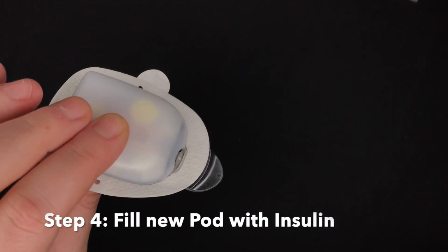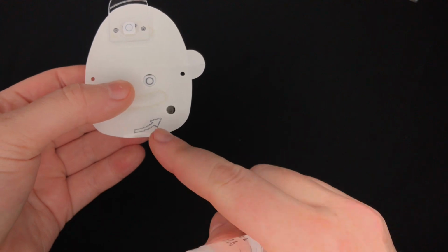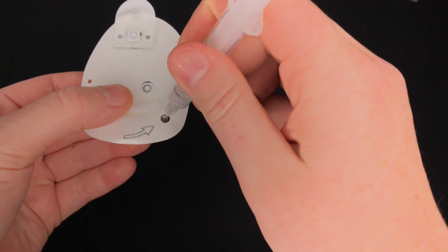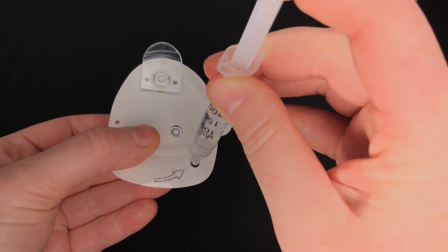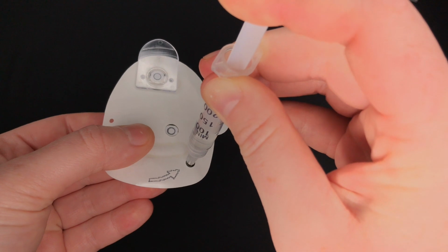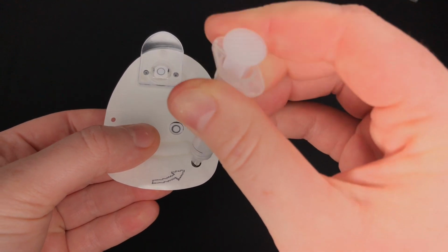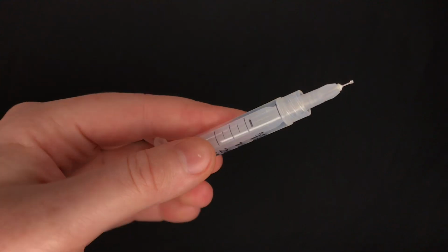Now for the actual filling of the pod. On the underside of the pod, you're going to notice this little arrow that points to this little hole. The hole is actually where your insulin is going to go into. So push this needle into the hole and gently push down all the insulin into the pod. You're going to hear 2 beeps. The 2 beeps will let you know that the pod is ready to be activated.